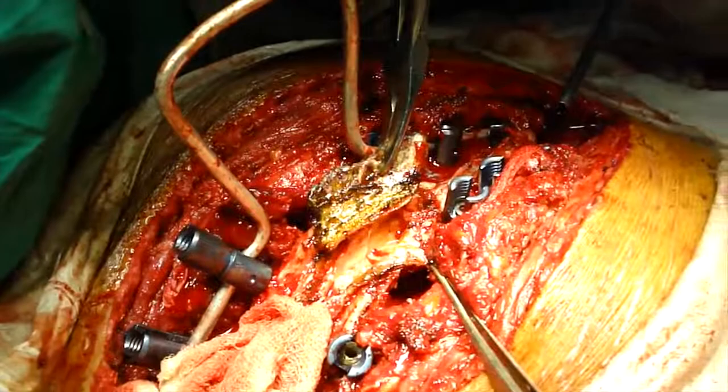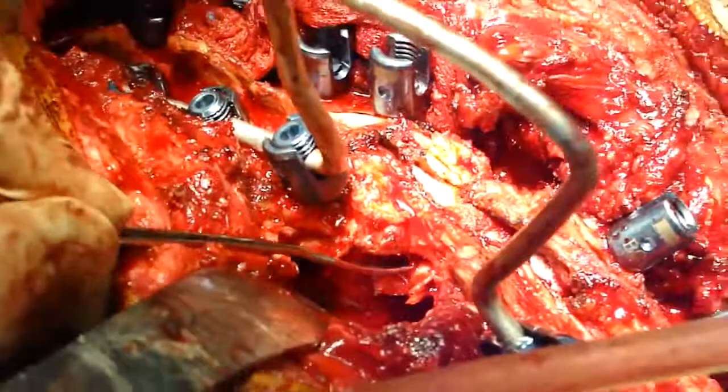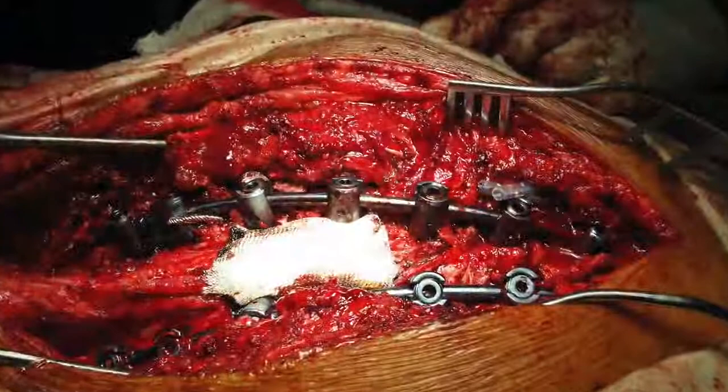After thinning down the posterior wall of the T5 vertebral body, the remainder of the bony wall was gently broken down into the ventral cavity. Once complete 360-degree decompression was confirmed, the kyphosis was corrected by gradually capturing the reduction screws over contoured rods. The osteotomy defect was simultaneously shortened over a 10 mm cage.